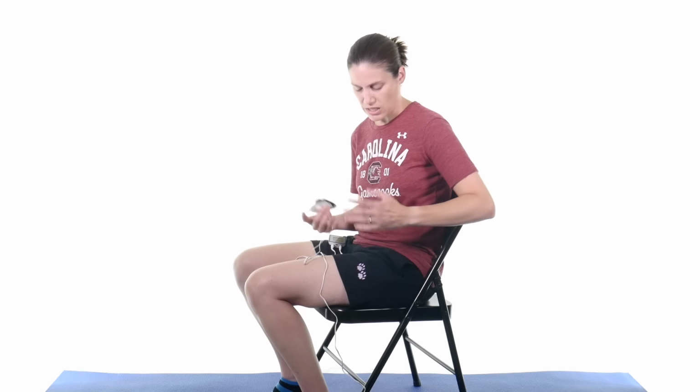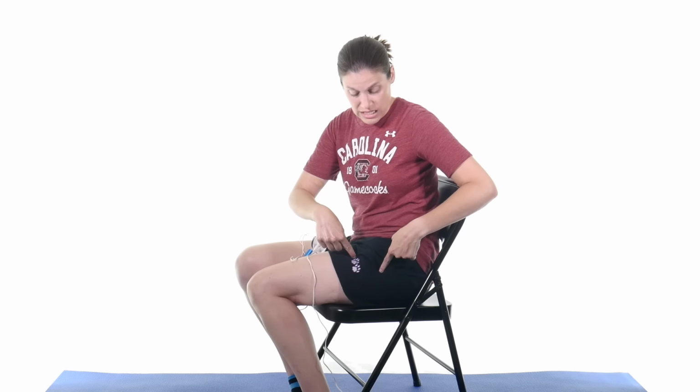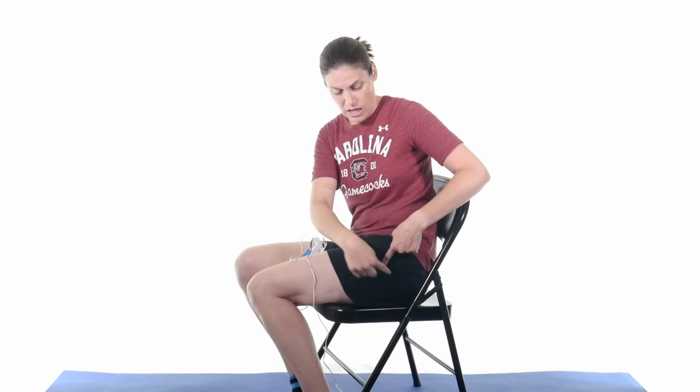What's really nice about this is you just kind of stick them on. It doesn't have to be specific. For a TENS unit, you're just trying to get the general area. You don't have to be exact. So if, for example, maybe I was having some hip bursitis, that greater trochanteric hip bursitis right there, when you get that point tender spot, you're going to put an electrode here for one channel, and then an electrode here and an electrode here for the other channel.